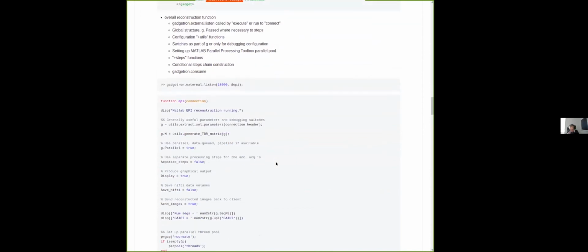So we had some really large Docker images. I think that's particularly the 16.04 images because Gadgetron moved on to new versions of C++, and we had to recompile large parts of Ubuntu. So we had to install a new compiler and recompile Boost, basically building a system that's more modern than 16.04.